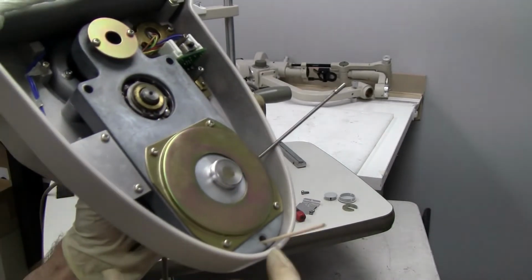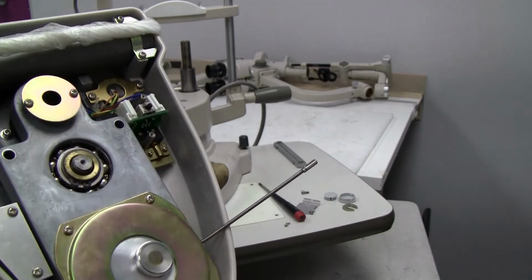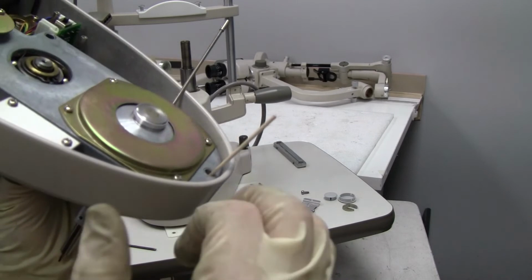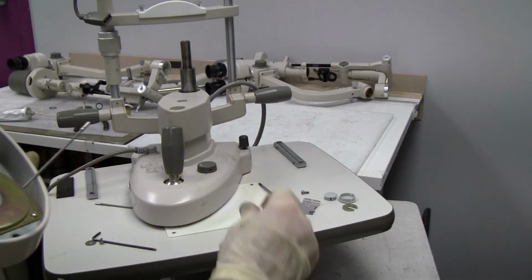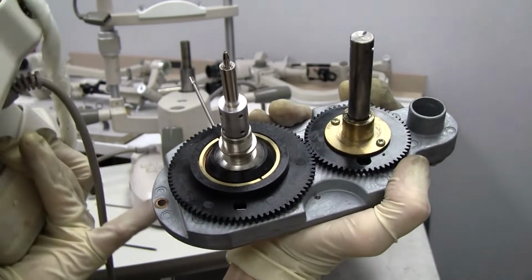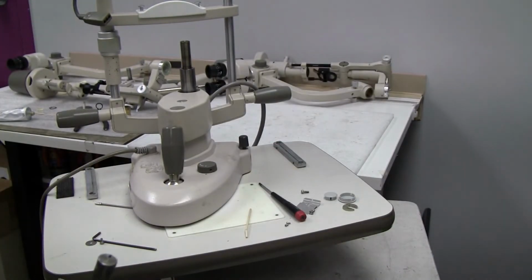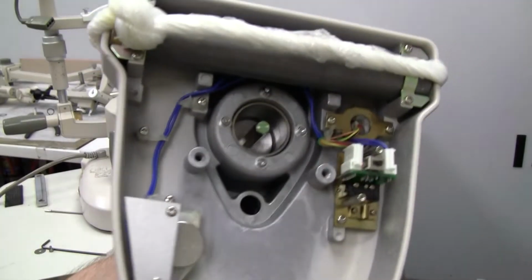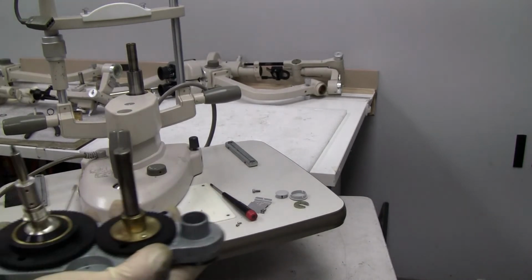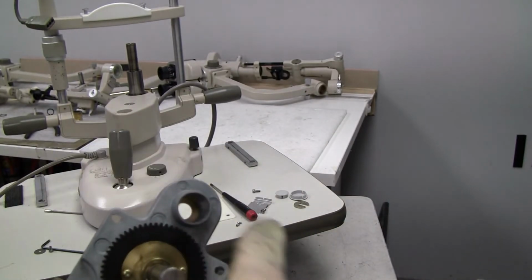Now this bolt is shorter than these two bolts, but they're both 4 millimeter, but this is the shorter one. But that little washer is important. See right there, it stayed on there. Sometimes they stay on, sometimes they don't, but that needs to be there. Okay, now that you've got this apart, you can put this to the side. And now you can work on this area.